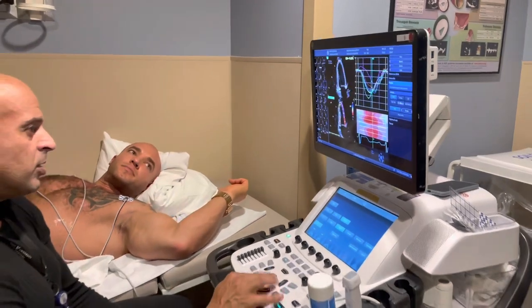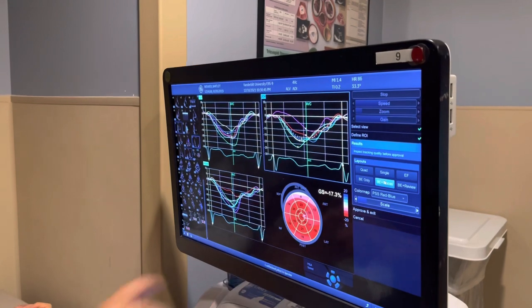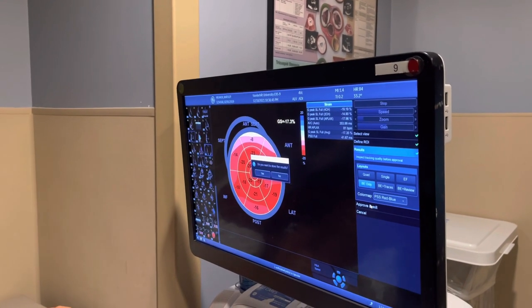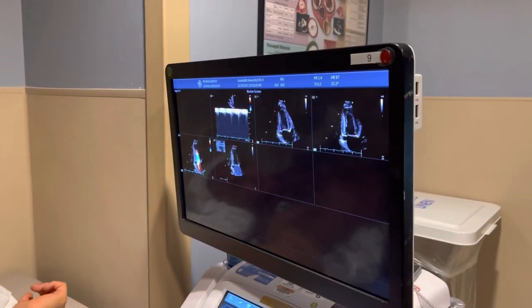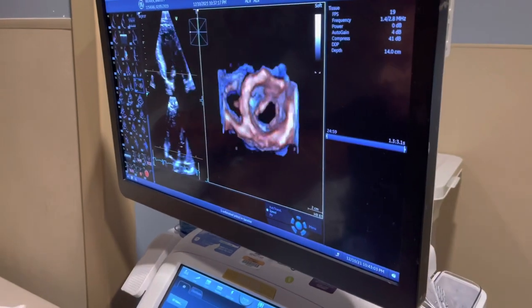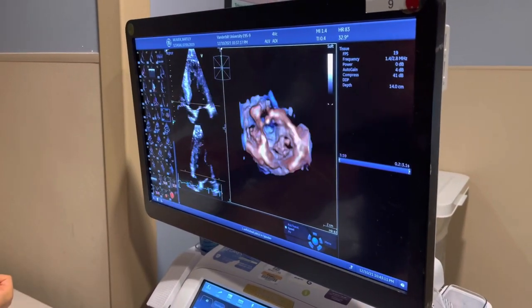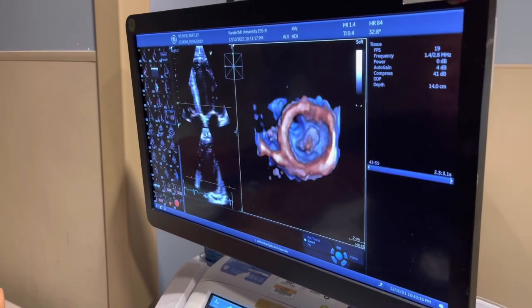Strain analysis looks really normal. It takes every segment of the muscle and analyzes it — I won't complicate it too much. It's very, very normal. The next important thing everyone knows about an echo is ejection fraction. What ejection fraction is — basically how much percentage of blood is being pumped out of the heart with every beat. We're talking about the left ventricle. His images are beautiful, textbook, so we can calculate it with 3D — which is the gold standard.